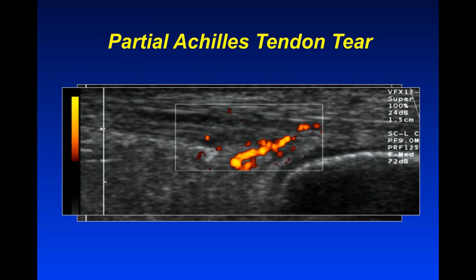We also have Doppler at our disposal. Normal tendons do not have any color Doppler within them, so when you see color Doppler flow it tells you two things: that tendon is abnormal, and it's most likely the cause of the patient's pain. When we put Doppler on in this patient, we can see flow going into the tendon — and that was the cause of her pain.